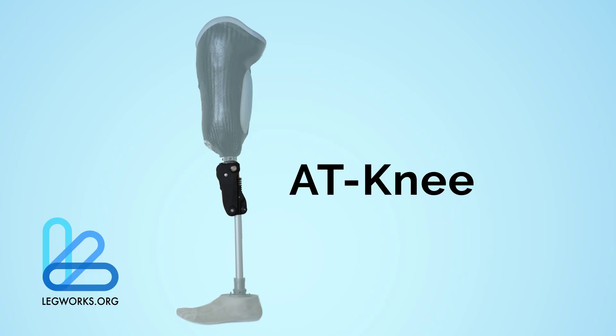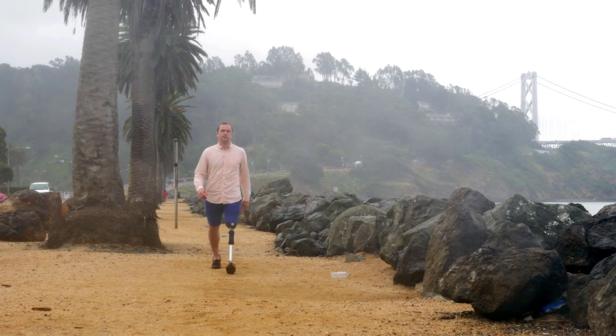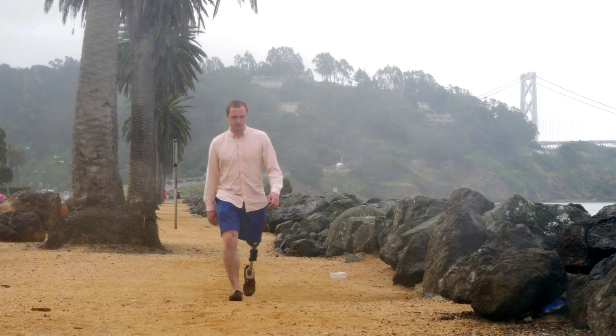With its patented automatic stance phase lock, the AT-Knee excites confidence in the user, allowing them to safely overcome everyday obstacles.